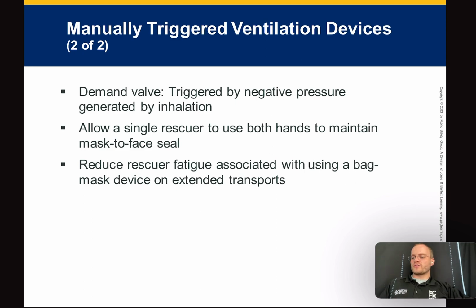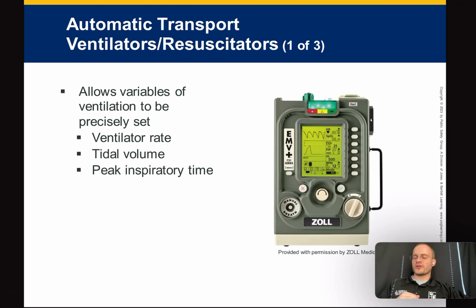And so, yeah, it's the manually triggered ventilation device. You don't see those a lot. So we actually have what's called, we have several different forms of these automatic transport ventilators.